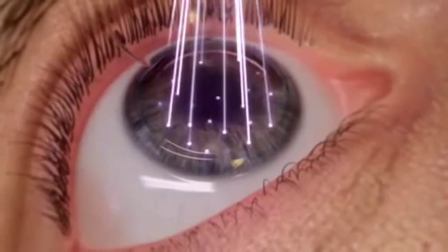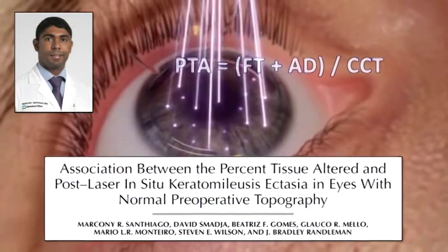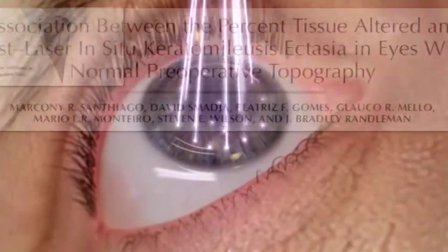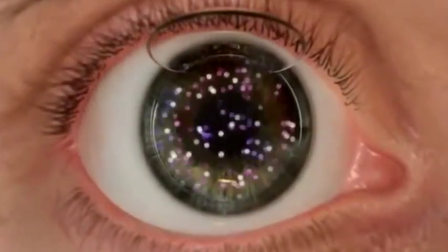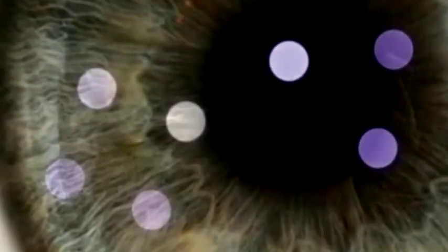The percentage of tissue altered introduced by Santiago and co-workers was found to be an important ectasia risk factor for cases with normal corneal topography. However, the biomechanical impact from surgery is more complex than PTA by itself, being related to the region and number of lamella that are severed during the procedure.